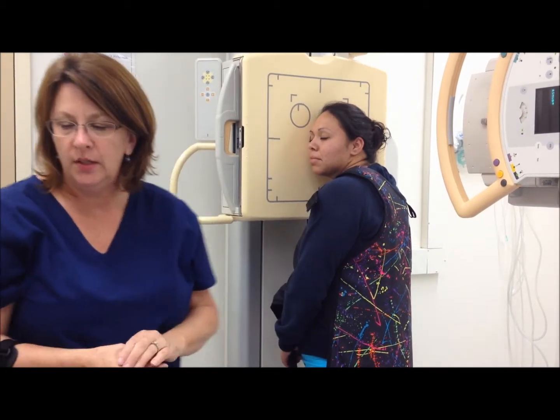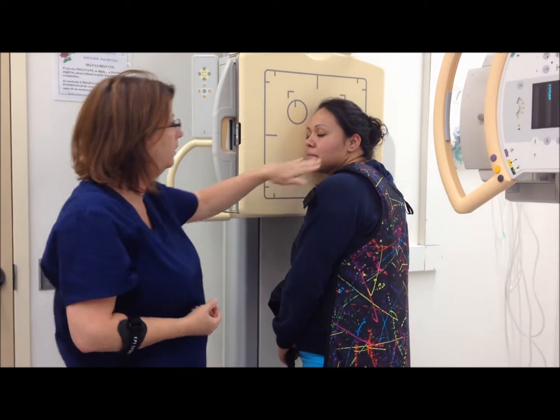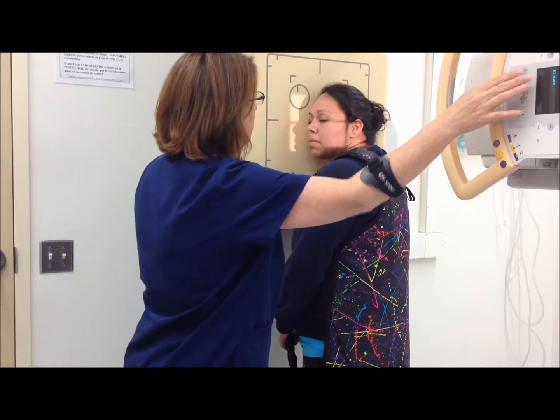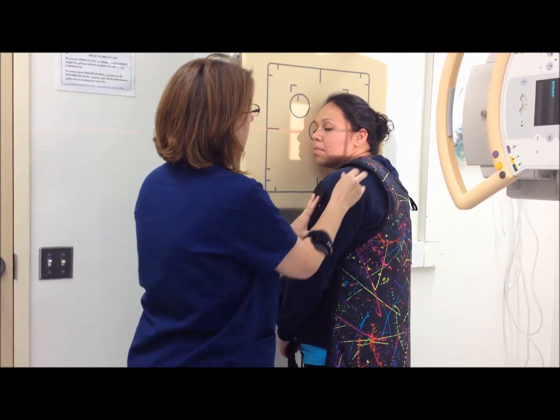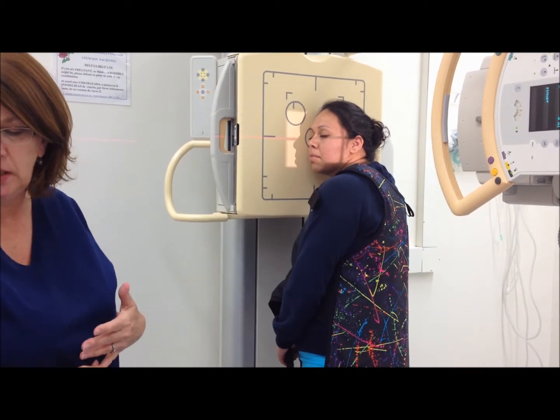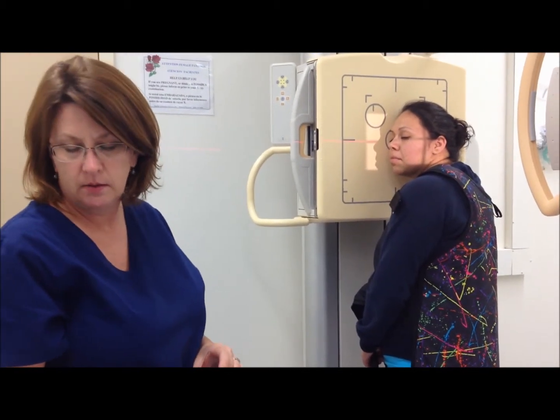My CR will enter horizontal. It will come in half to 1 inch posterior to the outer canthus. My technique will be 70 to 75 at 10 to 15 mAs.